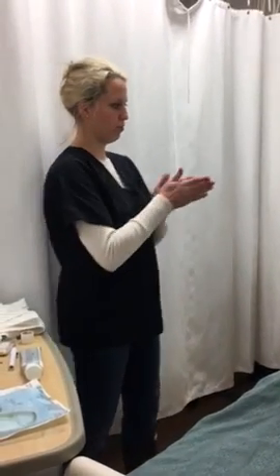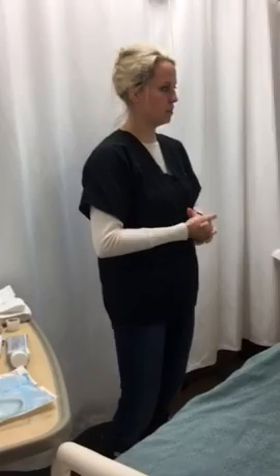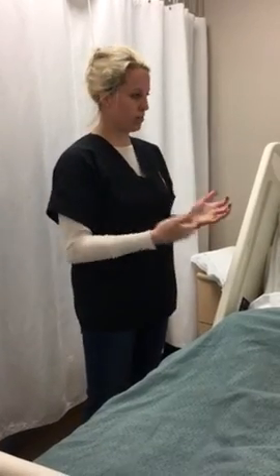Hi, my name is Cassie and I'm going to show you how to do an NG tube placement on a patient. So before I get started, I'm going to come into the patient's room, perform hand hygiene, and introduce myself to the patient. I also want to verify that they do have an order for an NG tube placement, which in this case our patient does.